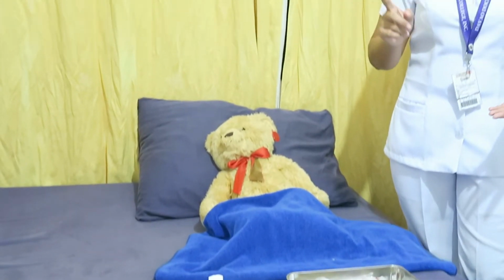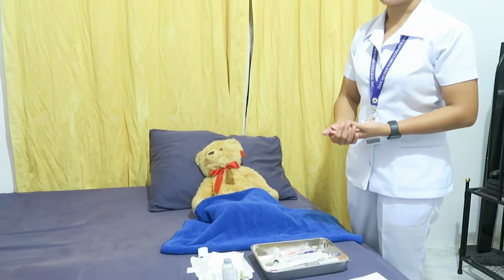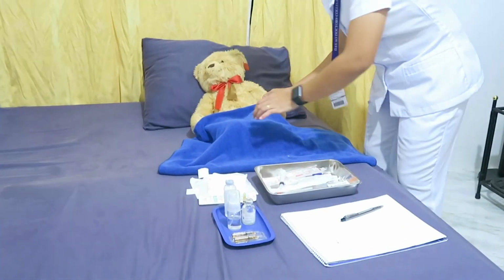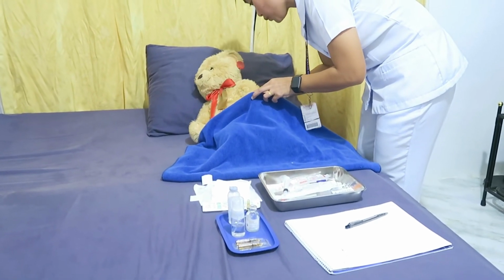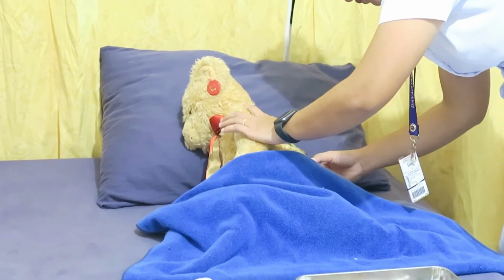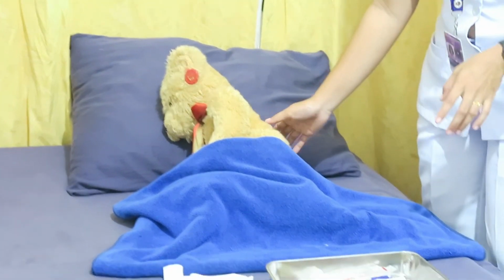So, select, locate, and cleanse the site. The rationale for that is, this is to reduce the discomfort of intramuscular injection. So, then after that, let's locate. So, ma'am, I will assist you, ma'am, ha? Okay, ma'am, thank you.